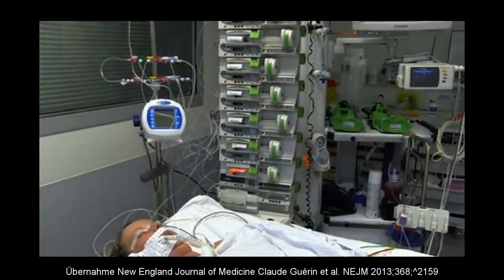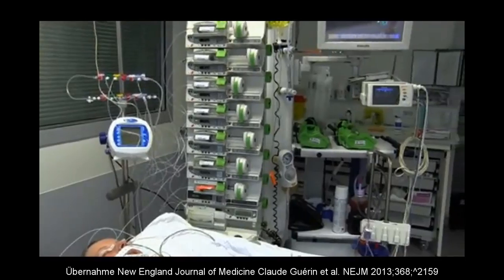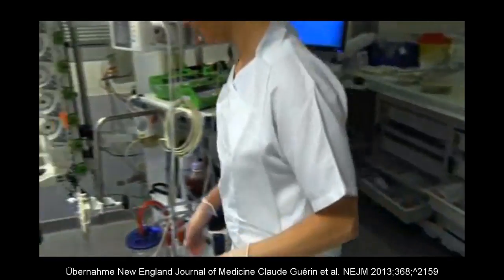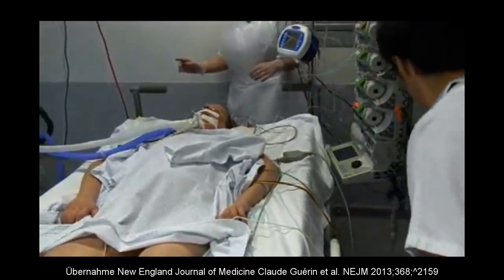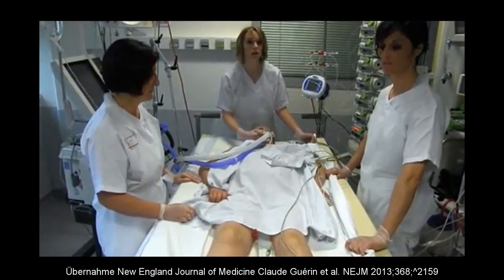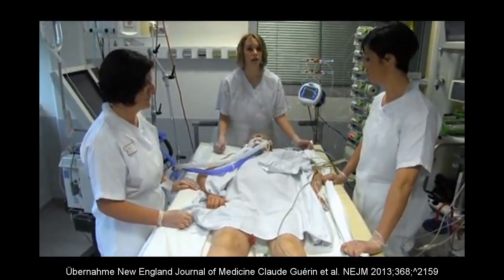One person remains at the head of the bed to secure the endotracheal tube and the ventilator lines. This person coordinates the procedure. The other people position themselves on each side of the bed. The procedure is performed following 5 steps.